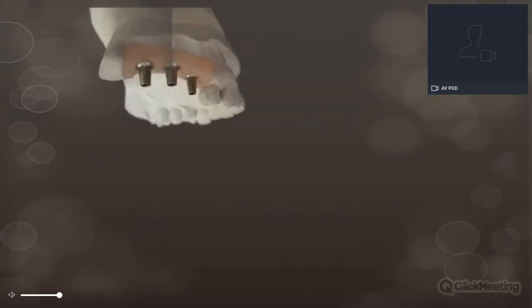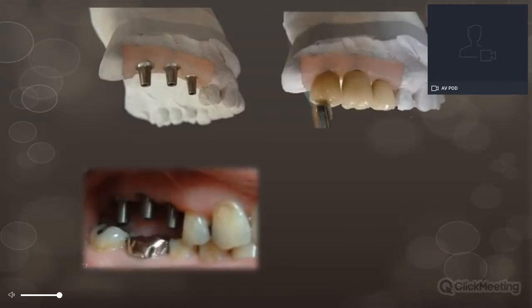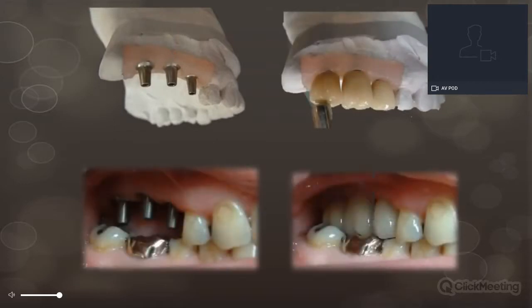Despite that, what we can see is a very predictable outcome based on good articulated planning, where we can see that the technician has carefully planned the outcome and achieved it according to the treatment plan and according to the placements he requested.